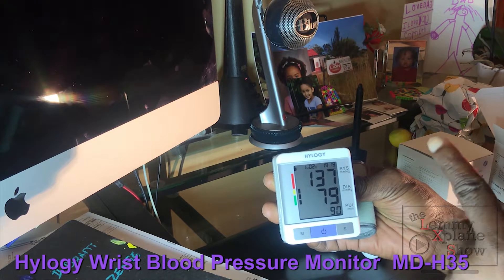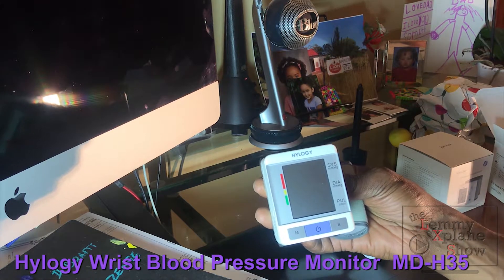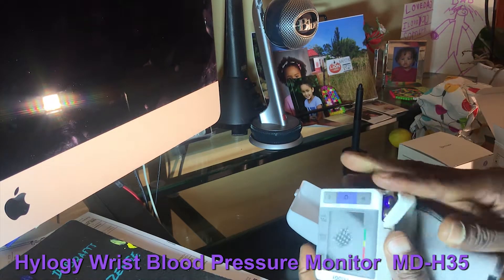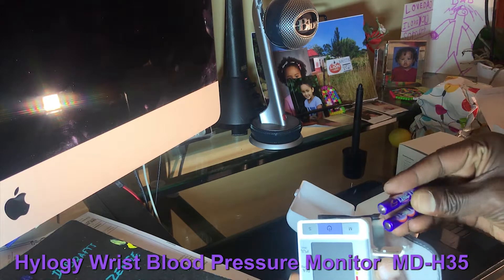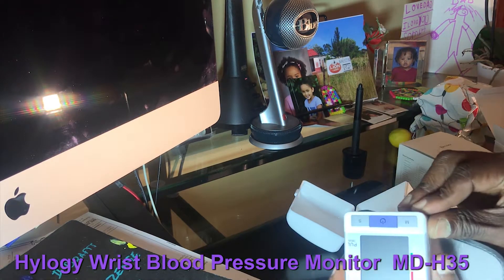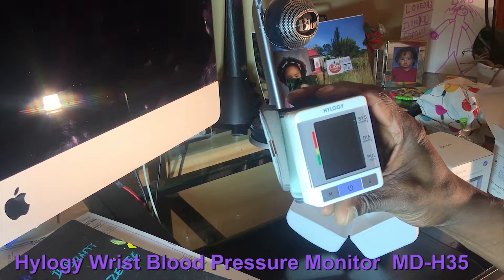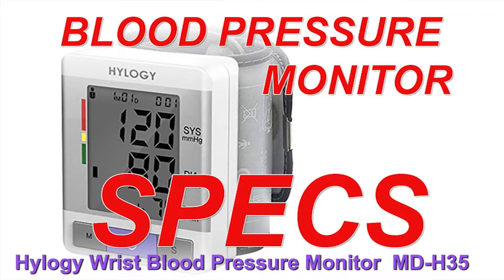It uses AAA batteries stored in the back — just two AAA batteries, that's all you need. I think it's a pretty handy gadget to have in the home if you have somebody suffering from high blood pressure.